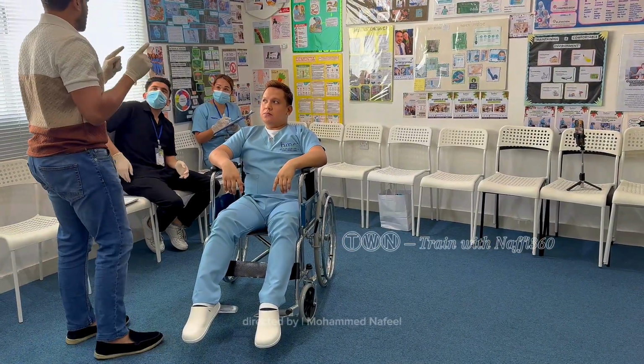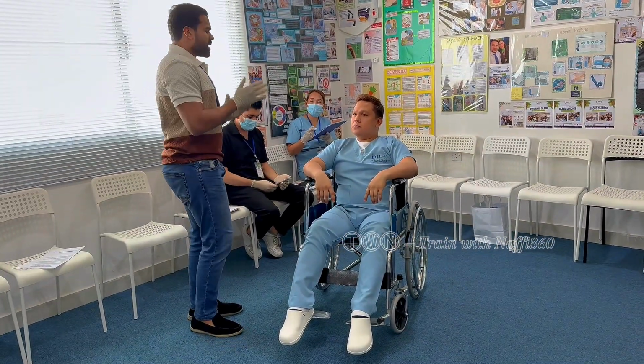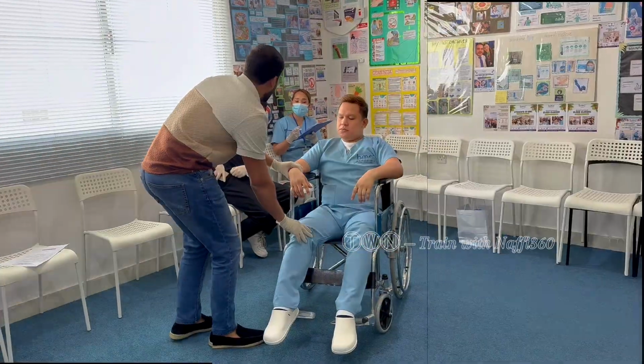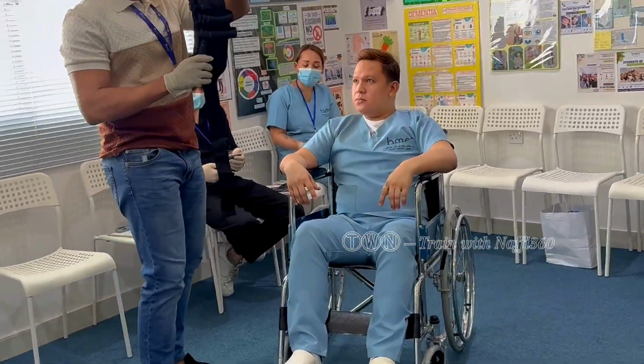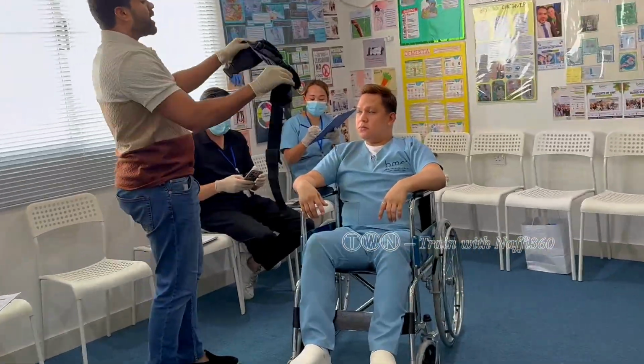As we move on, Section 1: Assisting from a wheelchair. When a patient calls for assistance from their wheelchair, the first step is to respond promptly and calmly. Approach the patient and communicate clearly. Explain that you are there to help them stand and walk safely. And also remember, before you touch the patient, to perform the sanitization process.